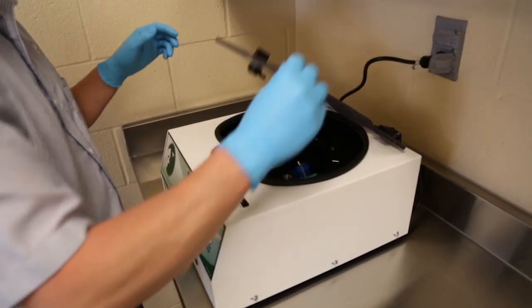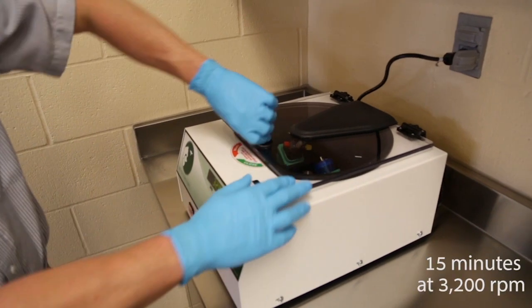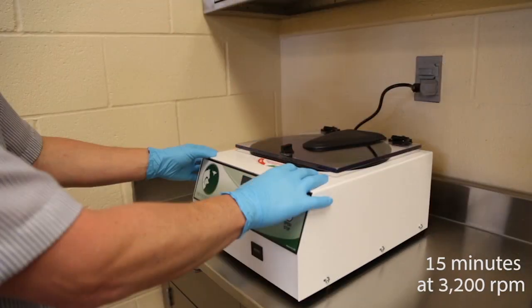Close the centrifuge lid and secure by turning the latch clockwise. Set the RPM to 3200 and time to 15 minutes and push the start button.